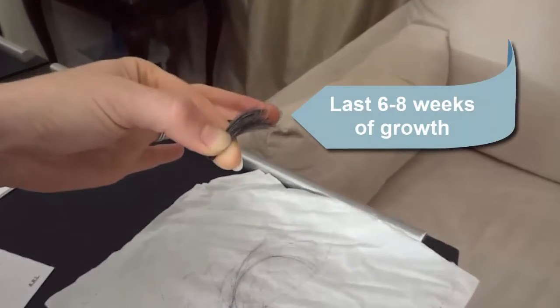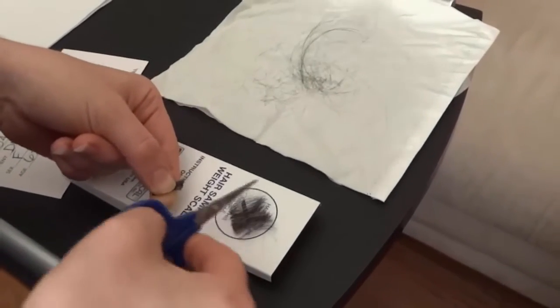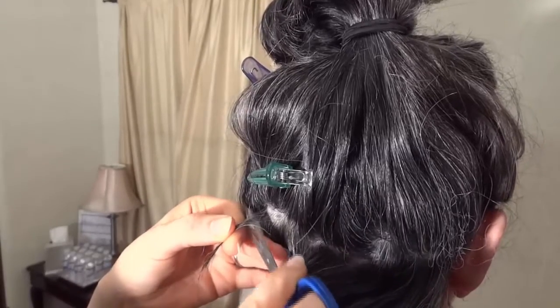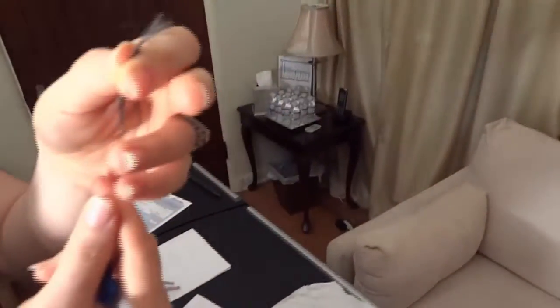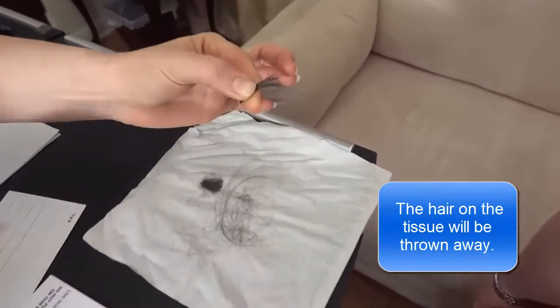You can then put that hair on the scale if you have one, or if you don't have the scale, you may use a regular kitchen tablespoon, which you'll want to fill until it is level with hair. We still have a little bit of remaining hair in that one sample location, so we'll collect that. And again, we are going to trim off the long ends of hair, keeping only the inch or inch and a half that was closest to the scalp.